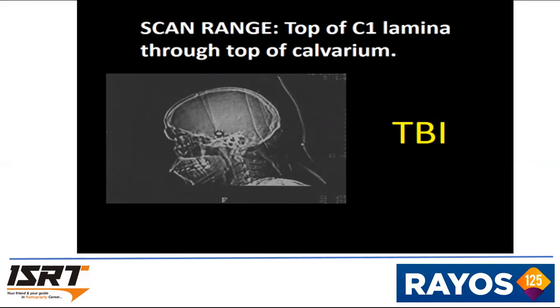While you are performing a CT brain, the area to be covered is very important. Usually, the area fixed is from C1 lamina to vertex. In traumatic brain injury, if the situation needs coverage from below, you can pull the box a bit lower than the C1 lamina, to C3 or C4 or up to the end of the mandible, and start the scan.